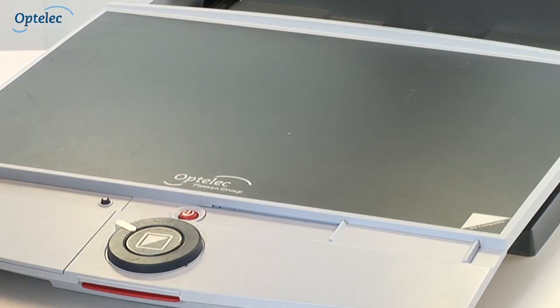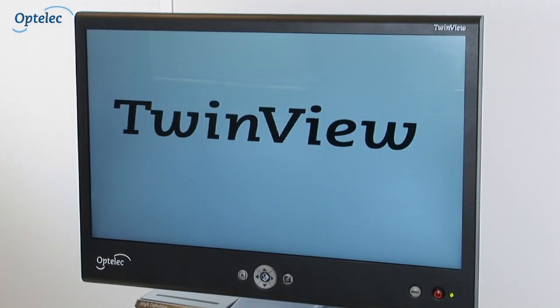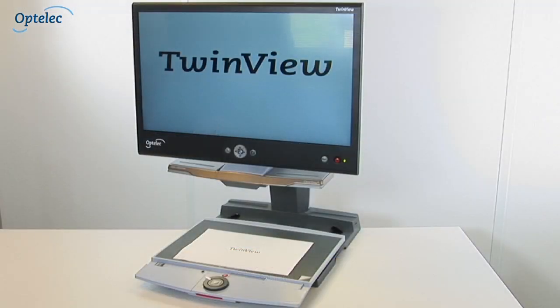If you prefer to use the TwinView in line with your desktop video magnifier — the Optelec ClearView Plus, for example — you can mount the TwinView to the standard monitor arm.